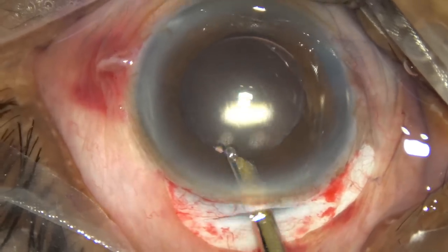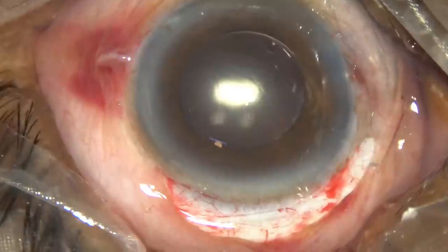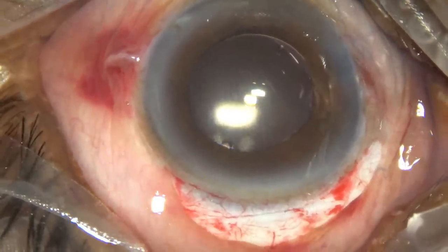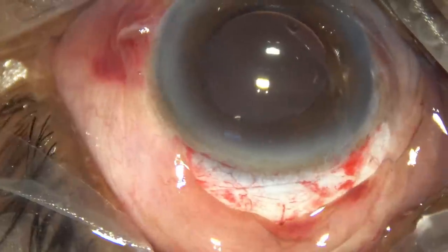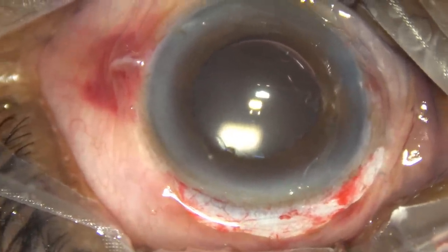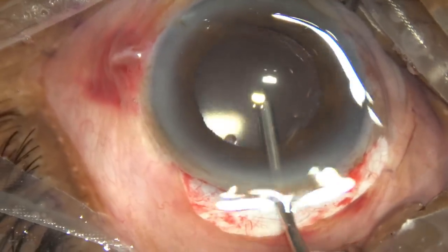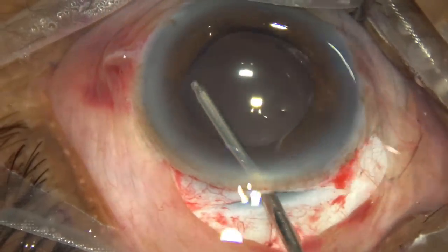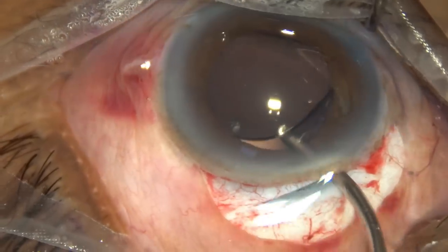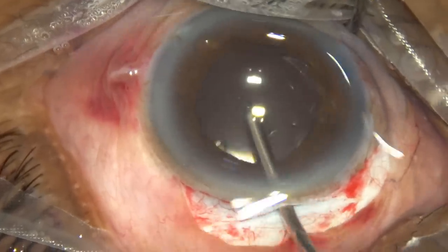This is nice cleaning of the cortex. This is irrigation of the anterior chamber and angle and the bag with BSS so that all the visco comes out.